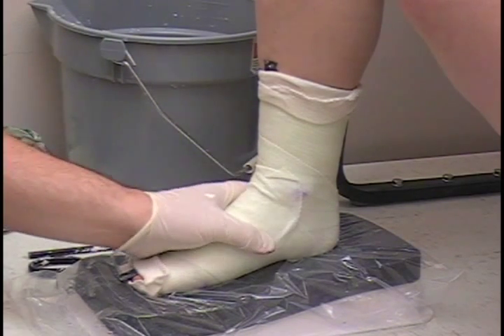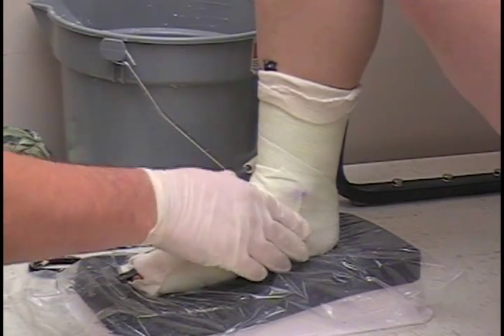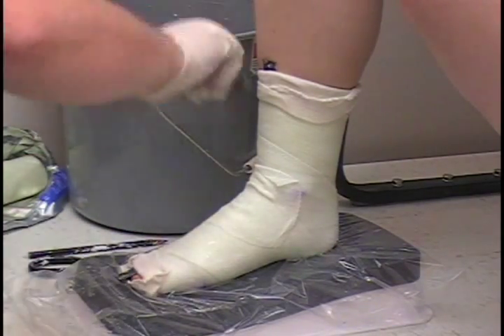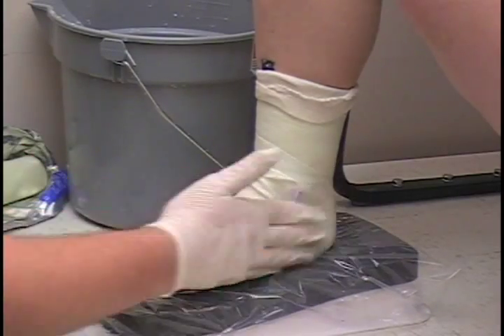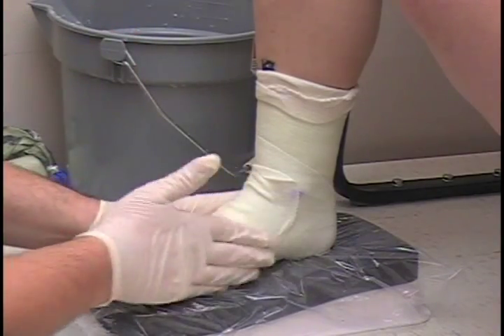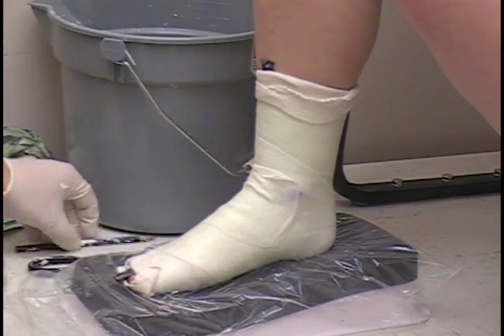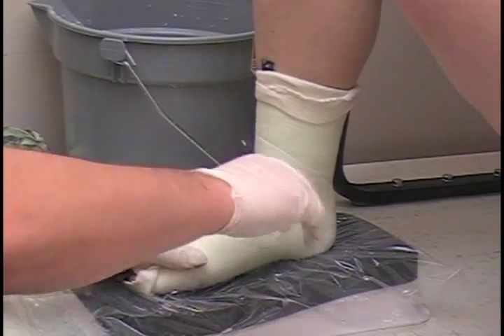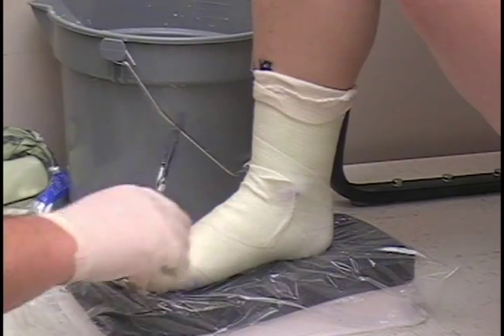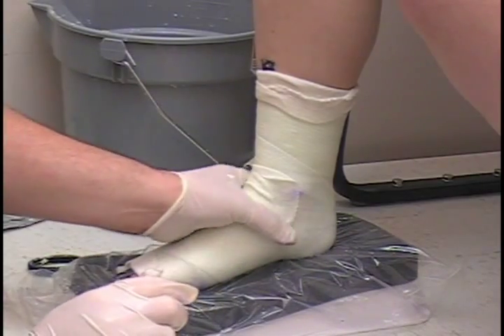It takes a few minutes for this to set off. Once it starts setting off, you tap with your pencil. Down here it's set off pretty good; up here it's still a little soft — just a few more moments.